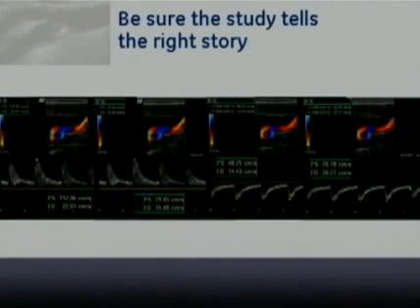You update the image, double check the location of your sample volume, and angle correct to the walls as it curves around. It's challenging to do, but make sure that the velocity values make sense. And sure enough, when I do this, my velocity is 70 centimeters per second, and that's more accurate. So in reality, in this coil, my velocities ranged from about 70 to 80 centimeters per second, never from 70 to 112, or down to 48. That doesn't make any sense.